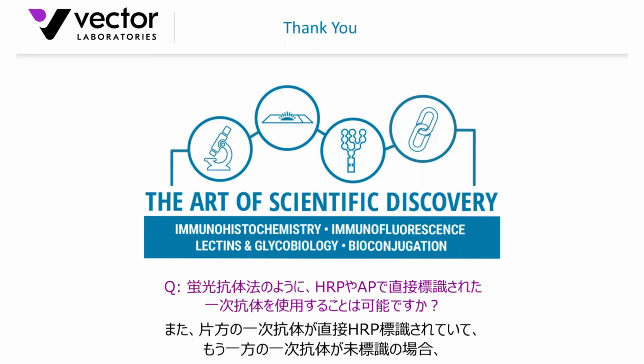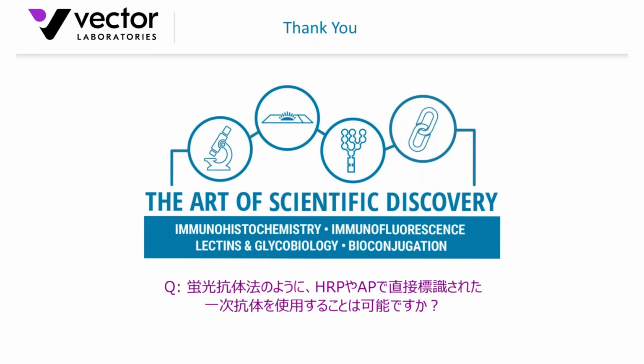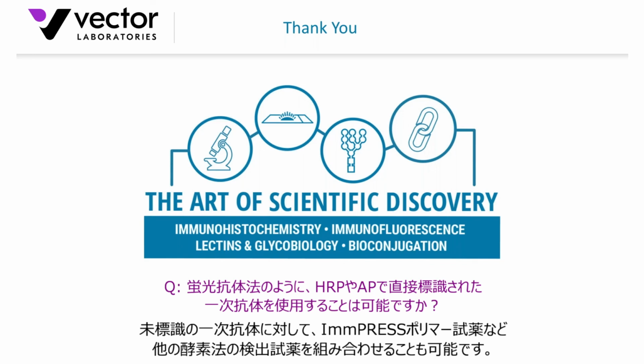But nonetheless, yes, you can certainly use, say, a mouse primary antibody conjugated with HRP. And then if you've got a second primary antibody that's unconjugated, you could use a different enzyme-based system or a different detection methodology to detect that, either with an ImmPRESS polymer-based system or whatever you've got. So, yeah, certainly you can use that approach.